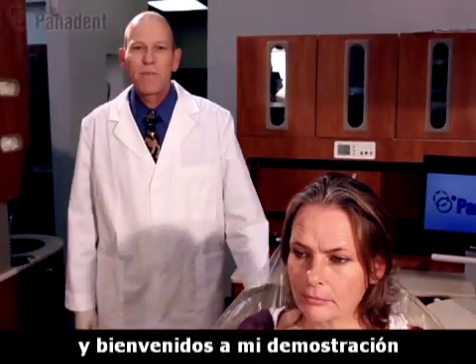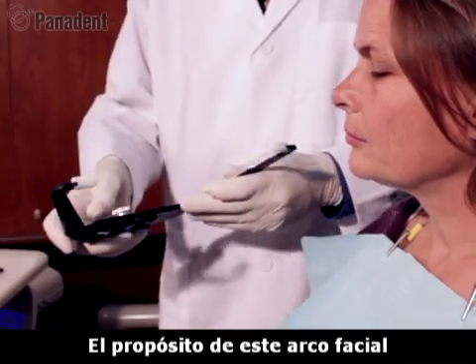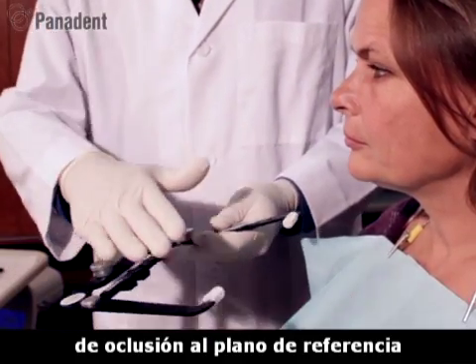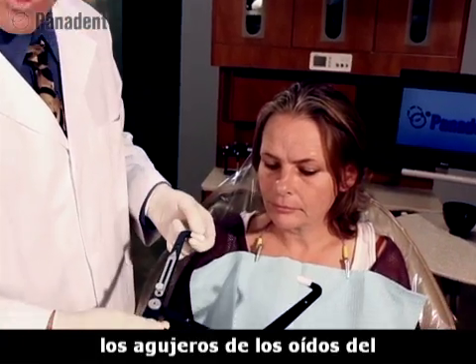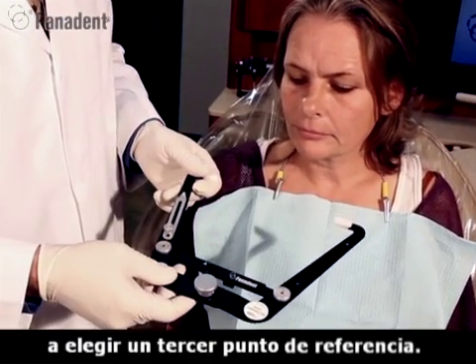Hello, my name is Tom Lee and welcome to my demonstration of the Panadent Face Bow. The purpose of a face bow is to relate the plane of occlusion to a plane of reference. The upper surface of this face bow is your plane of reference. We are going to orientate to the axis via the ear holes of the patient and we're also going to choose a third point of reference.